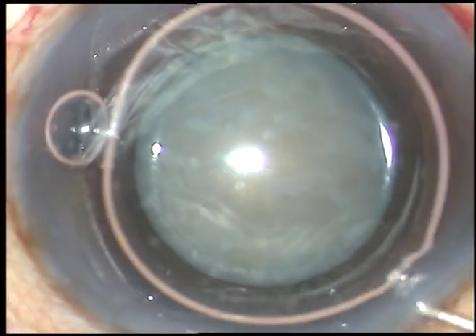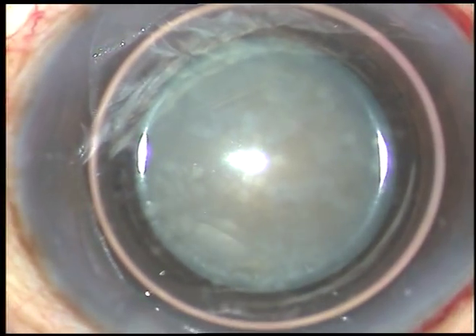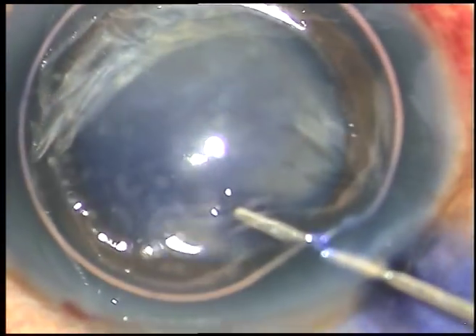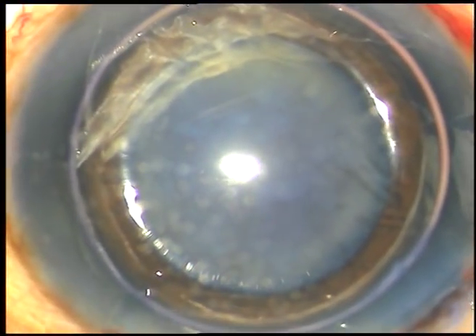The capsule is to be stained and I use an air bubble to use the dye. The dye is injected underneath this air bubble and after 5-6 seconds, the dye is washed out.